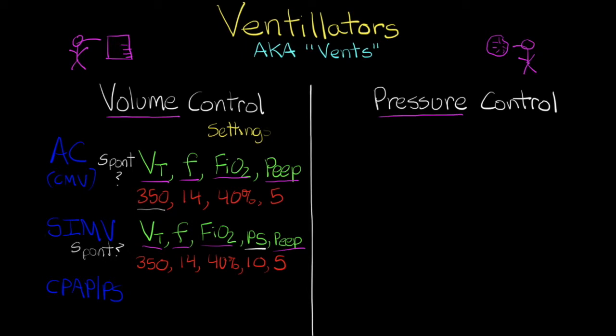The pressure support comes into play, like I said, when the patient is taking their spontaneous breath, and the vent is going to allow them to take whatever volume they take. So let's say we have a patient who is taking a tiny volume each time, only 75 mLs or 100 mLs or maybe 150 mLs. If we allow this to go on for long enough, the patient may begin to tire themselves out. They're going to become tachypneic, agitated and restless. They're not going to be getting enough of the air that their body needs, and that's going to cause our patient to be distressed and could potentially cause us to slip back on this slope of how much support we're having to give them.